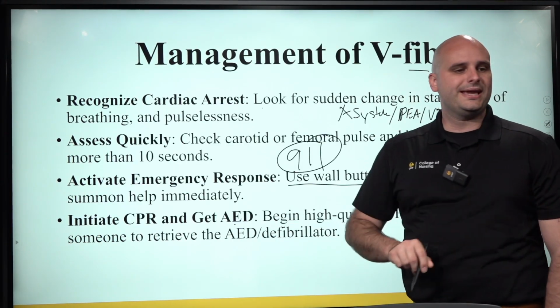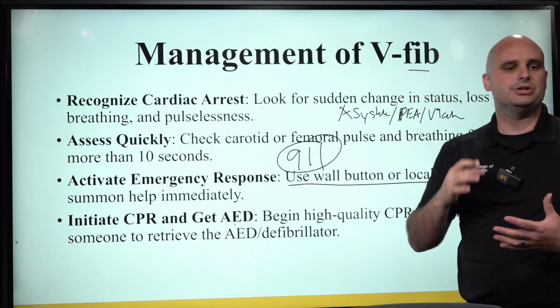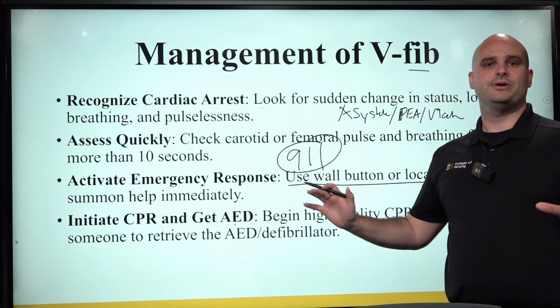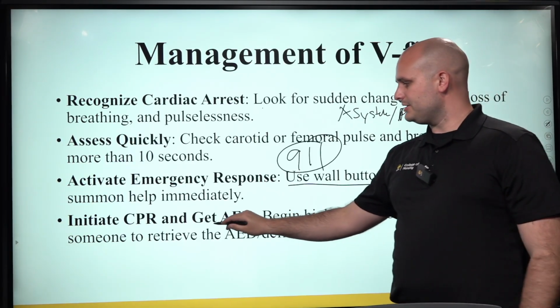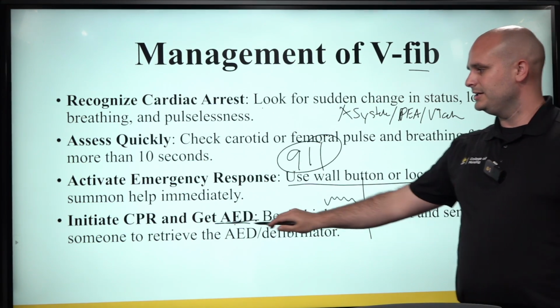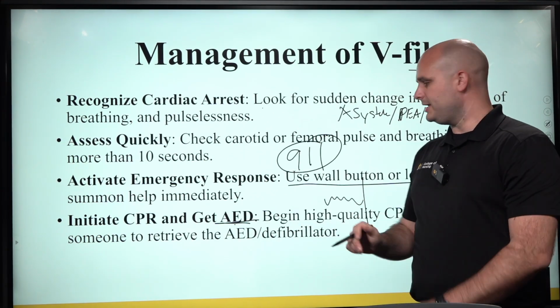And then we're going to get our AED, right? The only thing, and I want to stress this so much to you guys, you could be the best compressor out there. The only thing that's going to get them out is the AED. So if they're in a lethal rhythm, they need shocked. Your compressions could be great, but we need the AED.